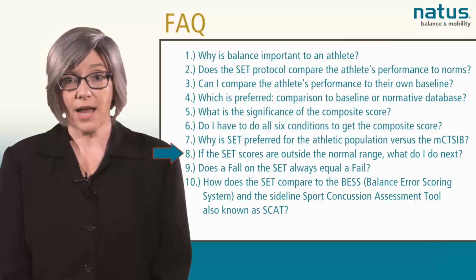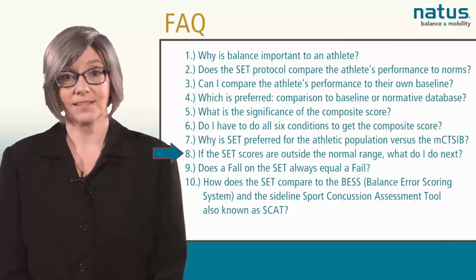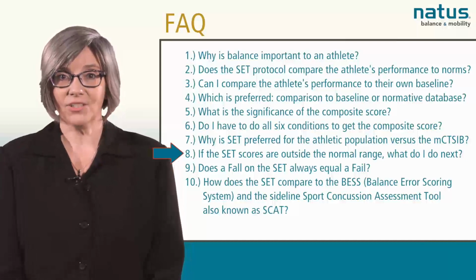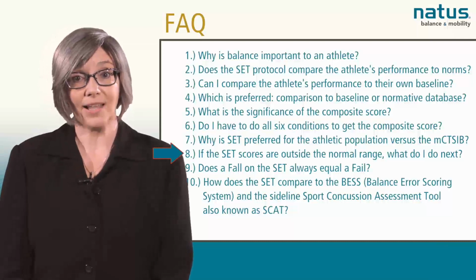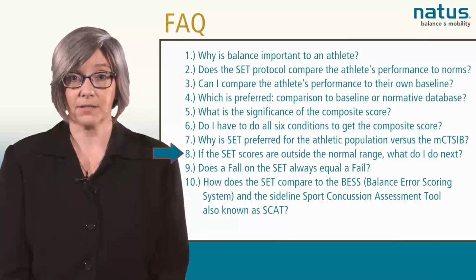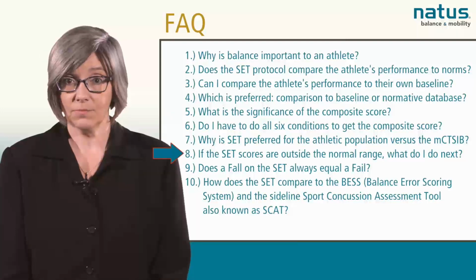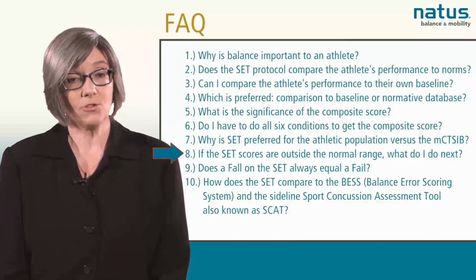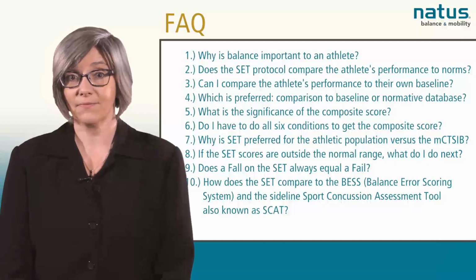If the SET scores are outside the normal range, what do I do next? If the athlete's scores are abnormal, your clinical judgment will help determine appropriateness for play and the need for further medical follow-up. The SET protocol score, along with symptoms and neurocognitive scores, may drive clinical decisions recommending further assessment and treatment.